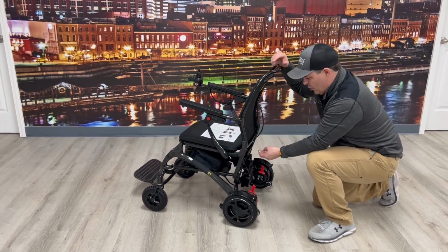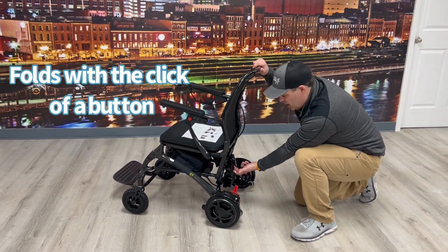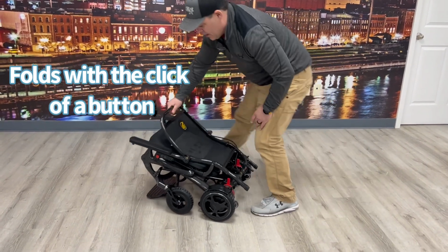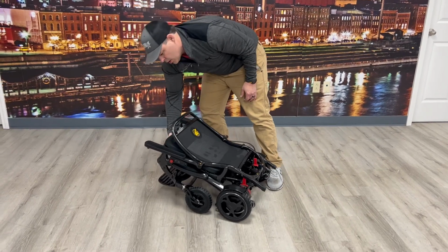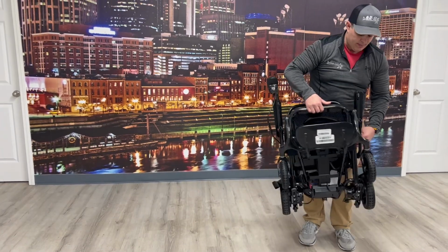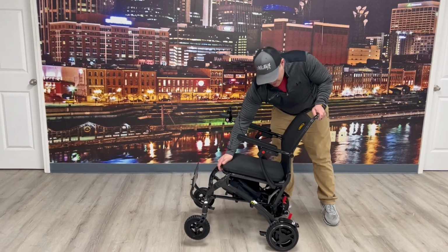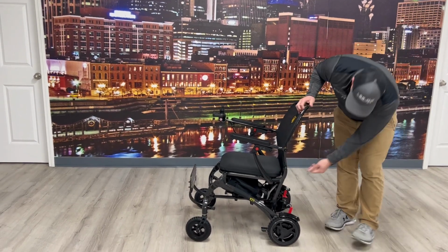When it comes to the folding side, there's a lever right here. All I have to do is unclick that and fold this down. So when I go to pick up, that's 33 pounds, okay? Want to raise it back up and unfold it, or I'm sorry, fold it back up. Just do that.